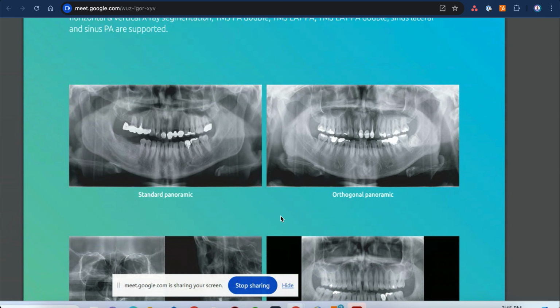This is the voice support system. If I am outside the room, before doing the dose, I can tell him, okay, can you hear me? Please stand still, straighten your back, and so on. It also gives assurance to the patients, because some patients are afraid. So just speaking to them is good, to keep them straight.